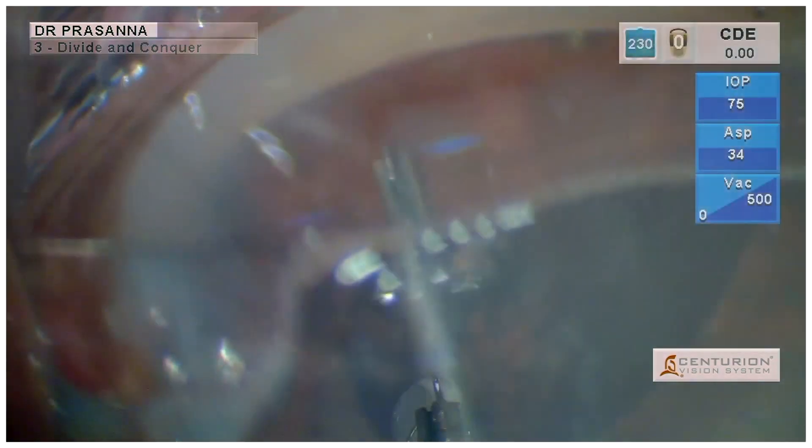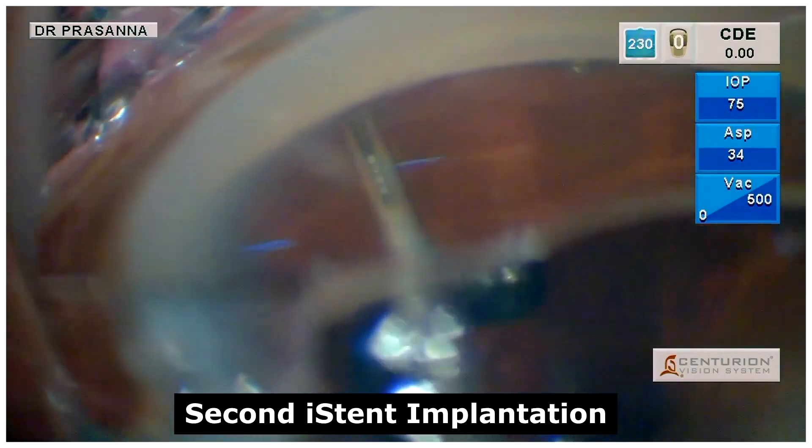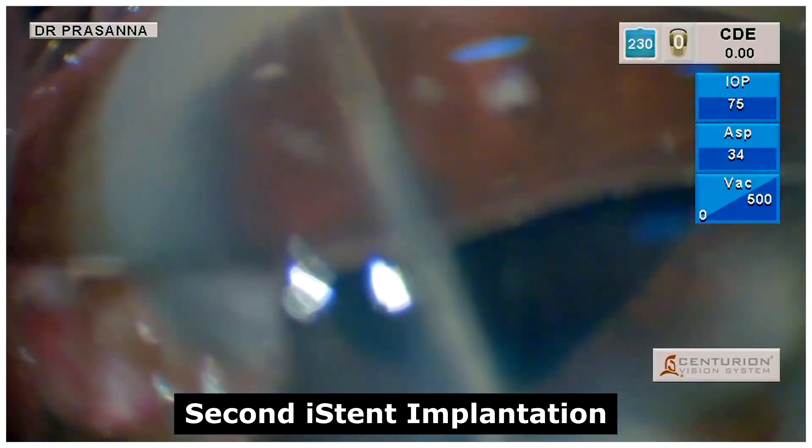Following which, the second implantation of the iStent was done with proper dimpling technique, ensuring that the iStent was well placed within the trabecular meshwork.